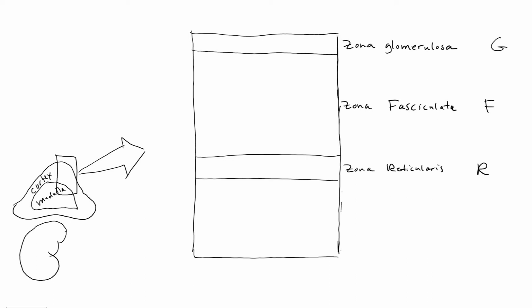Okay, the zona glomerulosa, you'll find the mineralocorticoids are released from this layer. Okay, the mineralocorticoids.